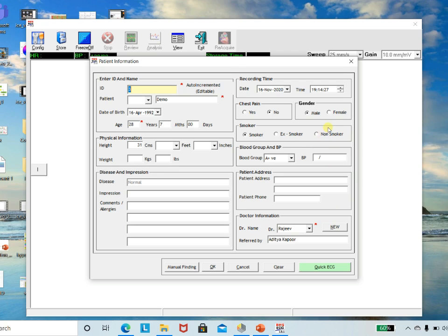After that, you will click on OK. So let me give a patient ID 1, then name, say, Mr. X maybe, and I'm not filling in all this information. I'm just letting you know how to use this software. So let me just click on OK.